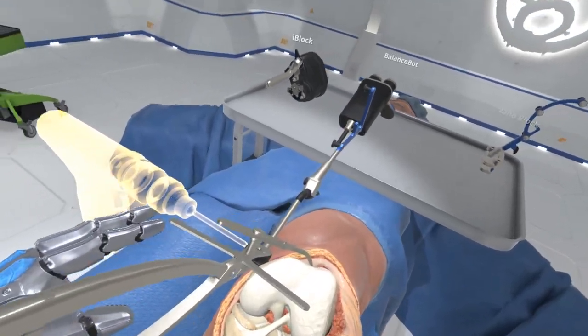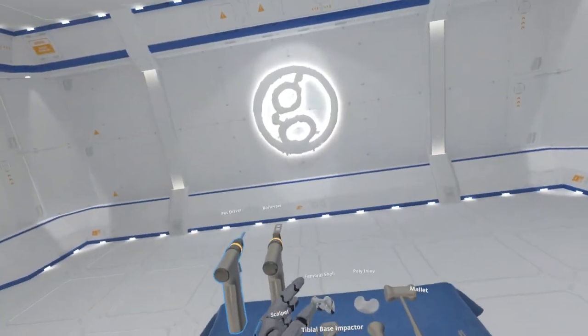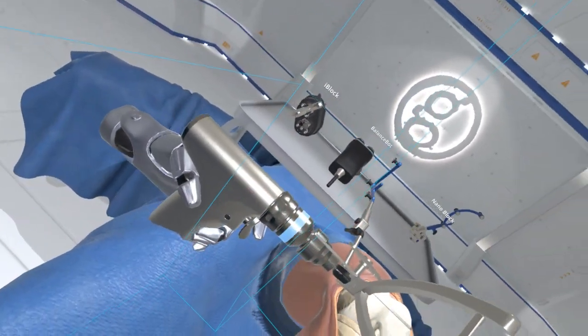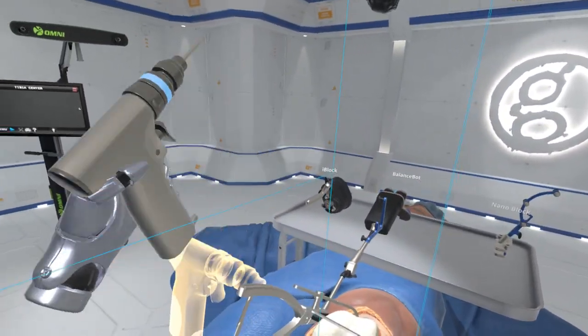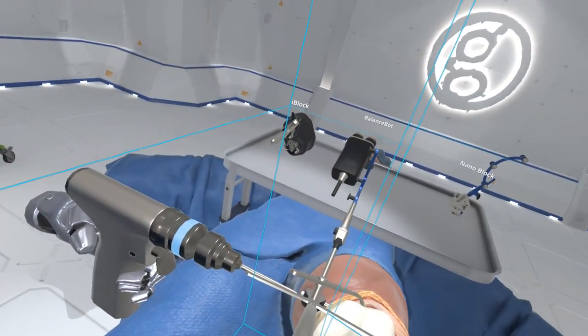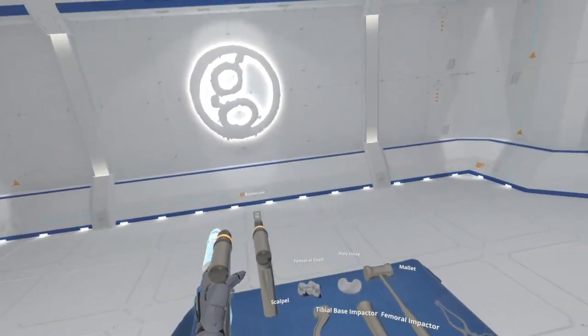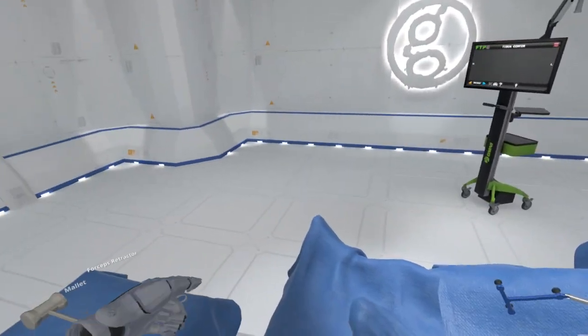Grab the pin driver. Pull trigger to install the first anchor pin, securing the femoral array. Grab the pin driver. Pull trigger to install the second anchor pin. Select the nanoblock. The nanoblock will guide the tibial resection.